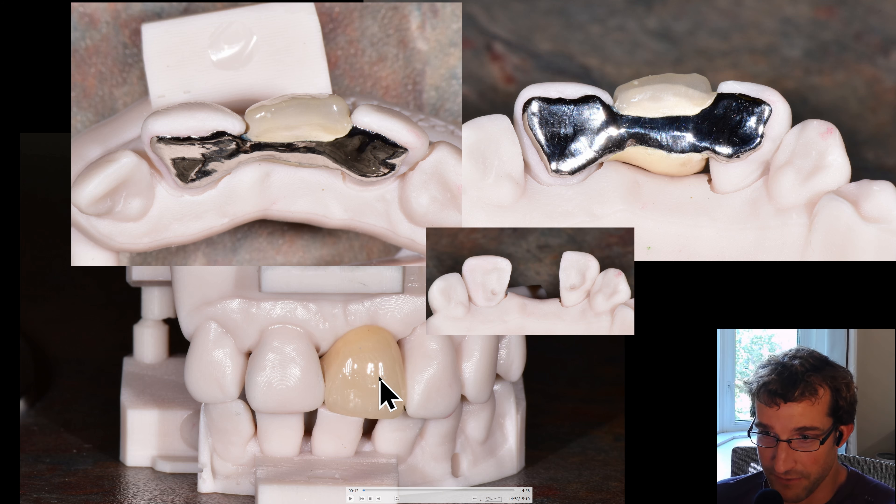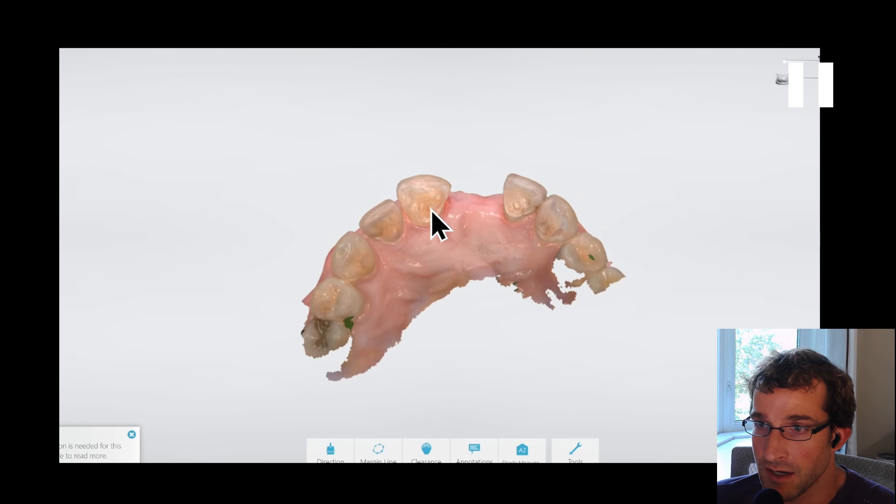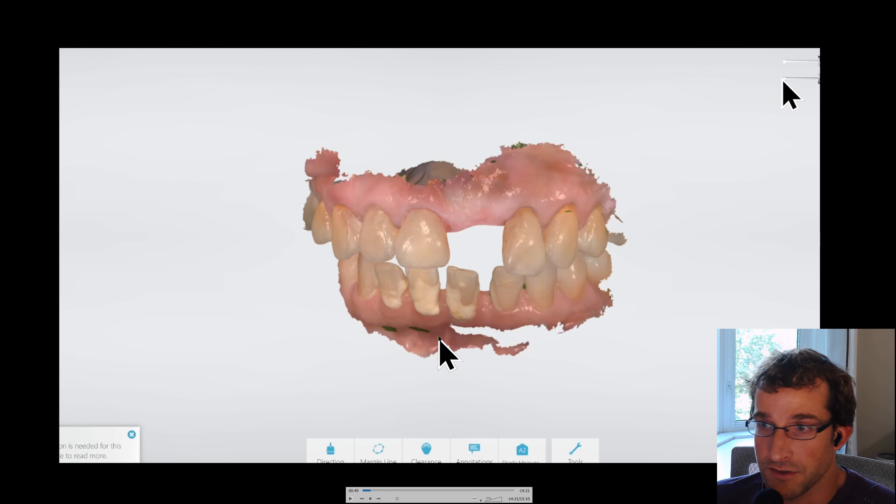So we'll get into the footage here. This is the unit as it came back from the lab — this is the high-value result. It doesn't look like it on the model, but it's too white. Here it is on the model. The preparations looked like this — we got nice good coverage. I like to make these little indexing potholes for additional retention. I haven't had a two-wing PFM bridge fail on me; I have had a single-wing ceramic Maryland fail on me. So this is how I like to do Maryland bridges. Here's the CT again that we never used because we didn't do an implant. This is the scan output and you can see the bite is pretty edge to edge — so this is like a perfect Maryland bridge case.